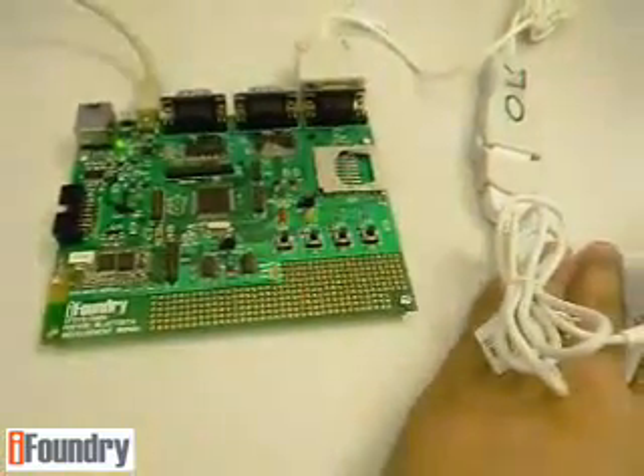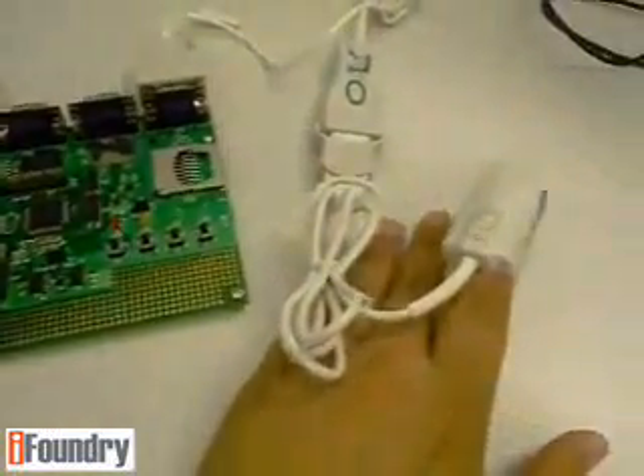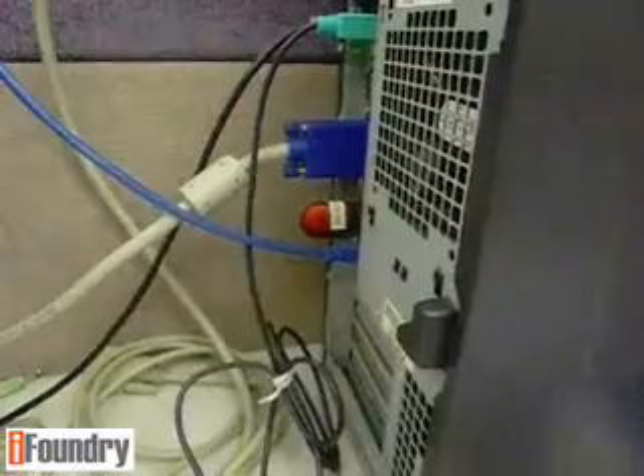Here we see that the pulse oximeter is connected to the board, and the data from the pulse oximeter is being transmitted over Bluetooth to the OxyClient application.